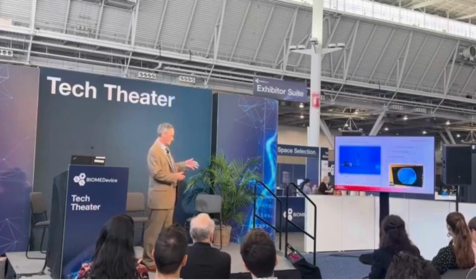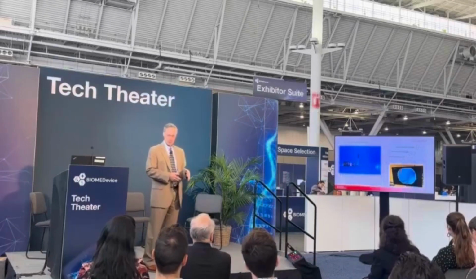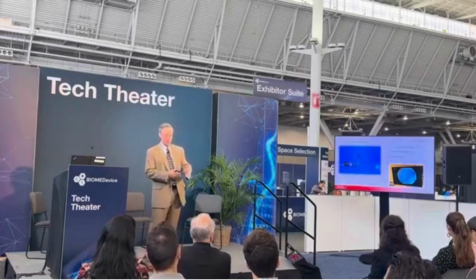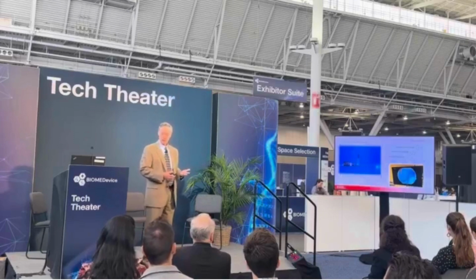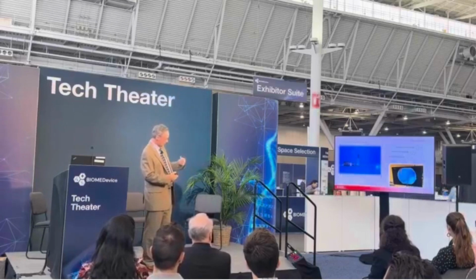If you don't know that, it's important for the orientation of the surgeon. It's a visual cue for the surgeon to know which direction they're looking, because they're concerned about all kinds of different things, and they want to know what they're actually looking at. So the camera companies put that little triangle in there to show the direction of view.